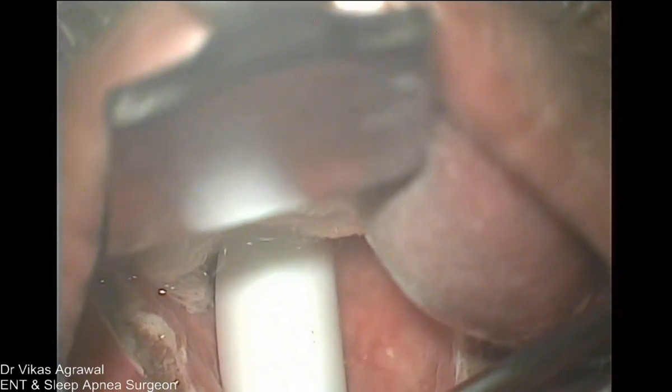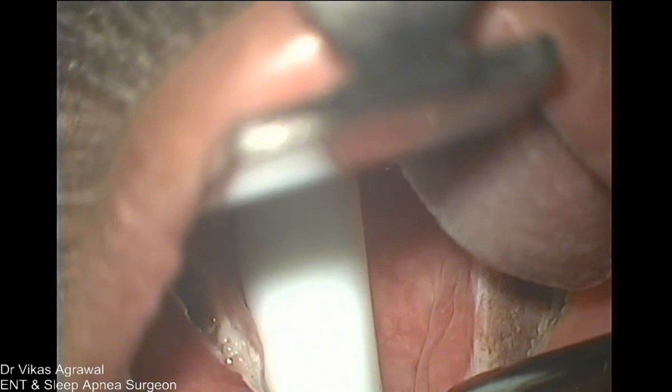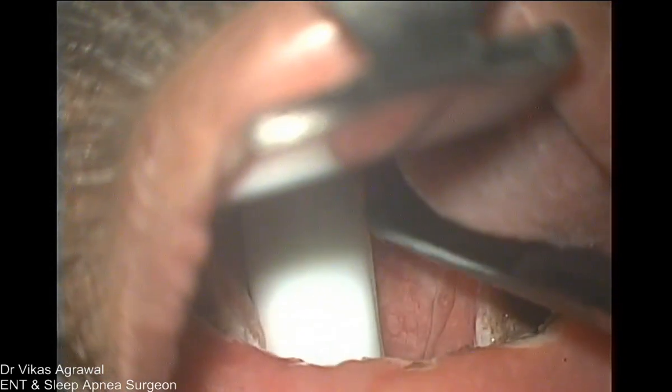Let us see what was... I'm just coagulating the raw area so that it doesn't bleed later on, because we saw two big vessels on the superior pole. Okay, now we'll come to the tongue-base surgery. It's 11:30. I think before 12 we should be able to finish our tongue base so that the rest of the session doesn't get delayed.